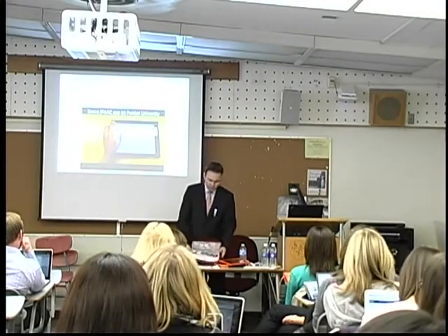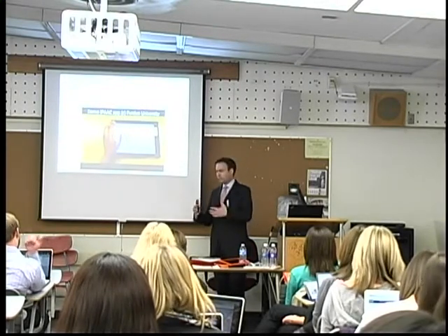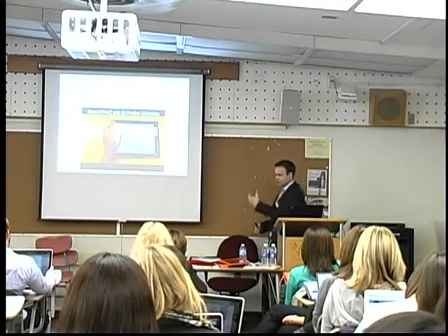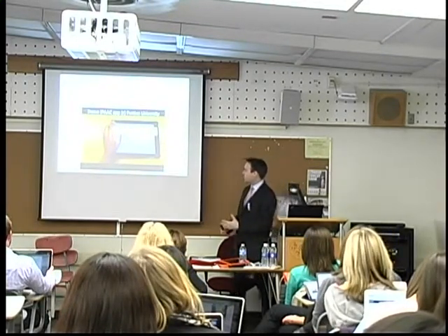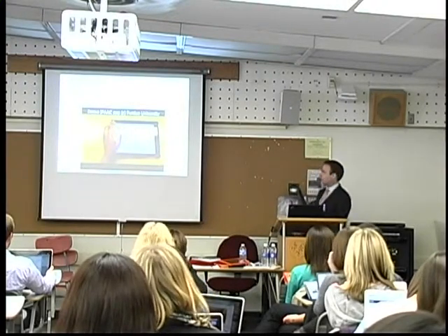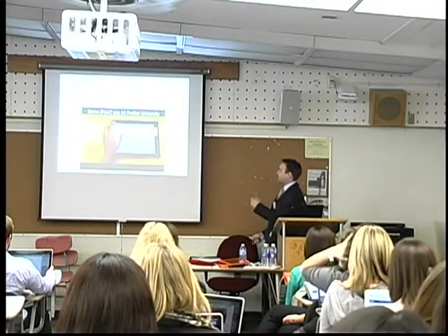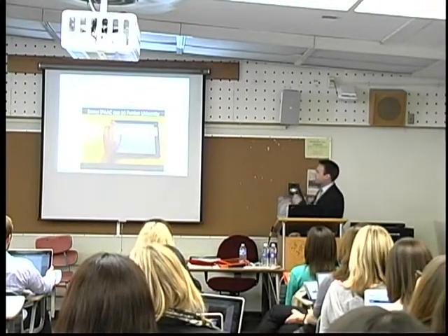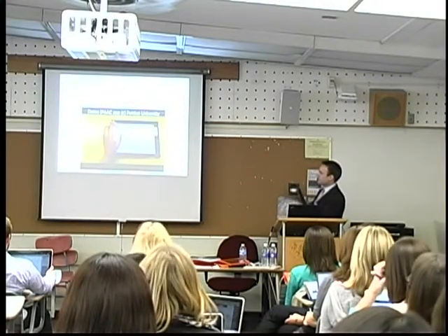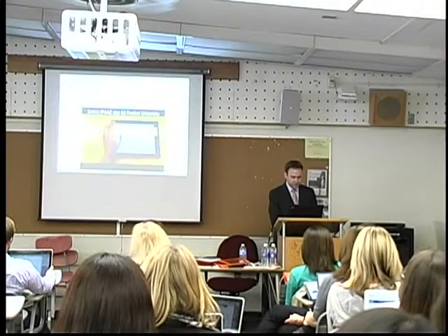And in those early days, there weren't a whole lot of apps available, and not many that we liked for these types of learners that were just making their first steps with speech-generating devices. So we decided to program our own, and at that point in time, it was called IPAC, Interactive Purdue AAC app or something like that. And here are the first steps of that individual on our iPad app prototype.